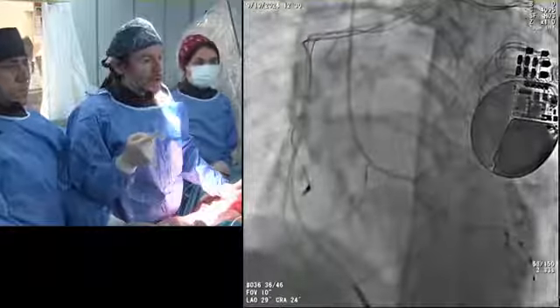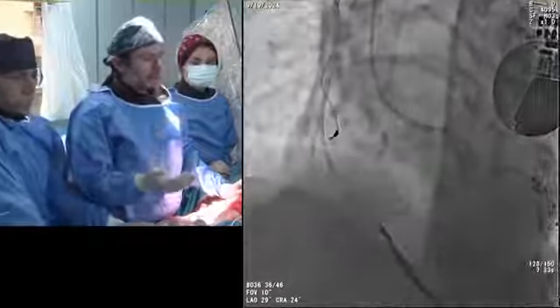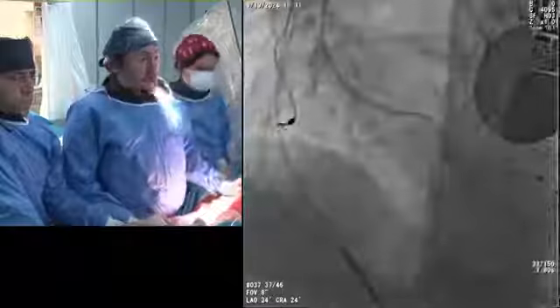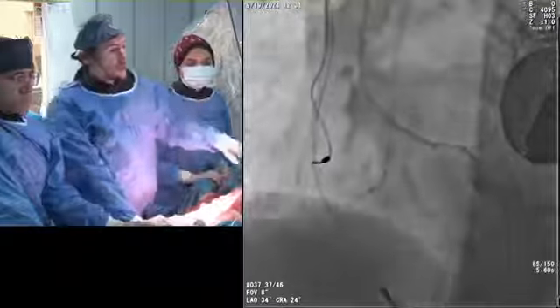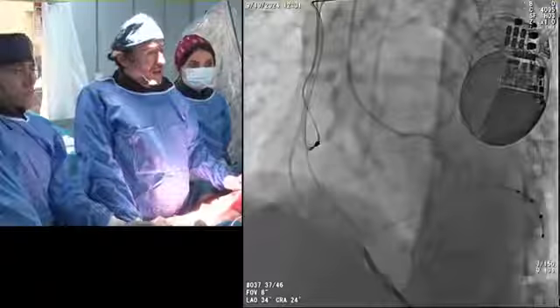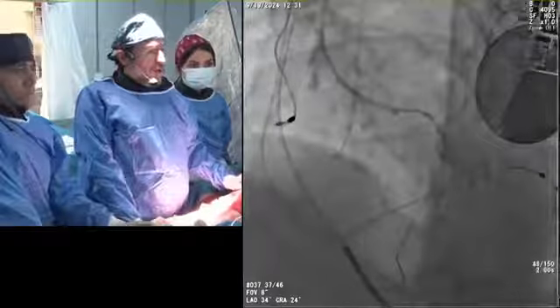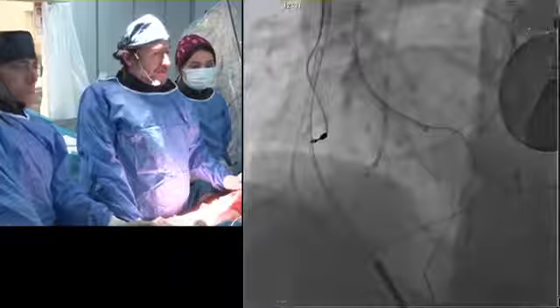And you see, it prevents the guiding catheter from engaging deeply into the left main. And this wire helped us a lot in preventing any dissection. So it was a good demonstration. I wanted to share it with you. And then we ballooned after externalizing the R350. And now we are doing the final touch. We stented the lesion. Next.